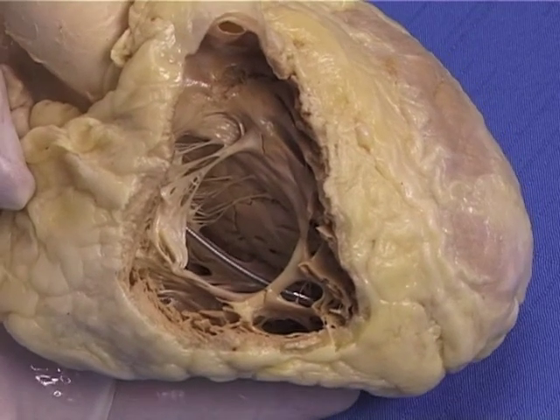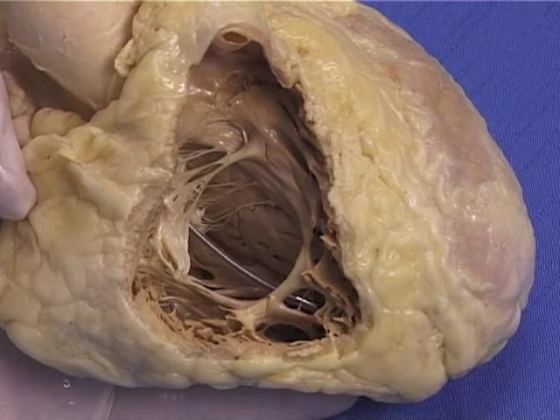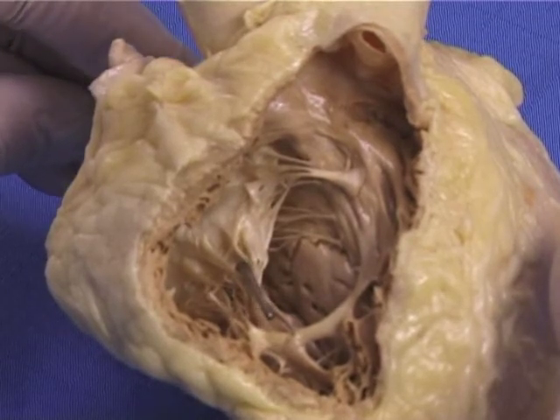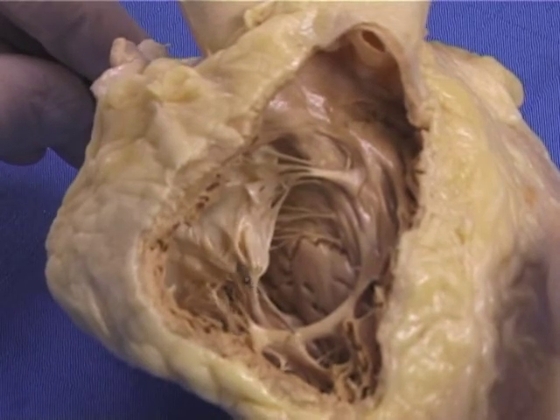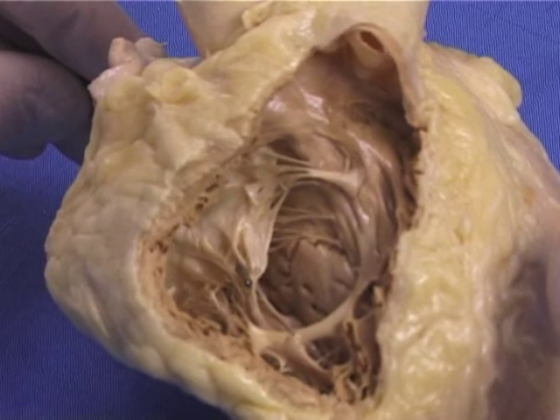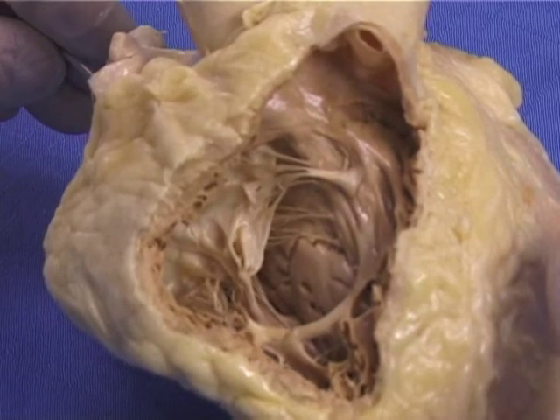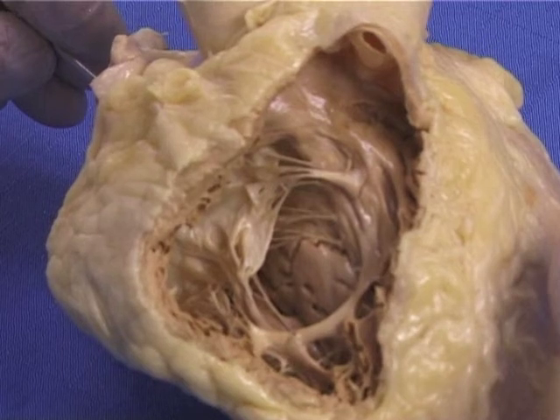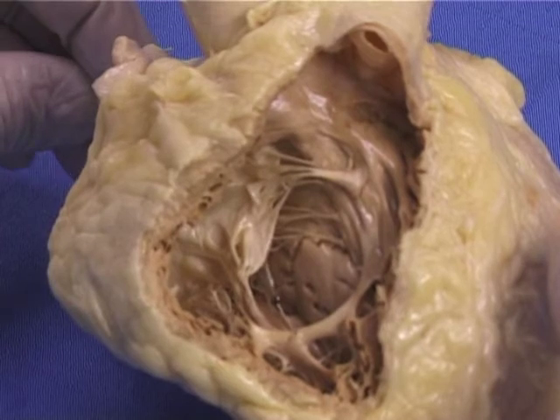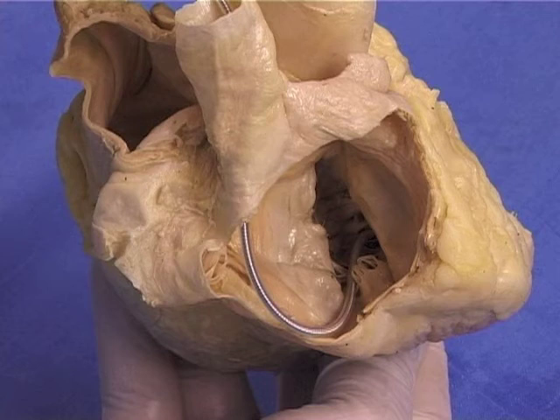Implantation of a lead into the right ventricle apex. For permanent pacing, a lead is inserted through the tricuspid ring to the apex of the right ventricle. While putting the lead through the tricuspid valve, it can pass between the chordae tendineae and can hook them together. In such cases, it is necessary to delicately and smoothly pull back the lead to release it. If the lead is positioned correctly, it is important to see the appropriate typical curve at the level of the fibrous ring of the tricuspid valve.